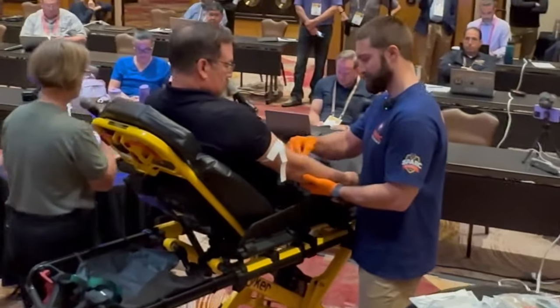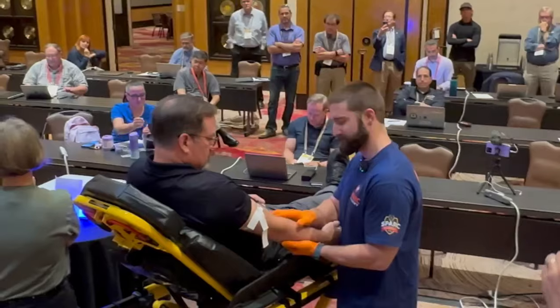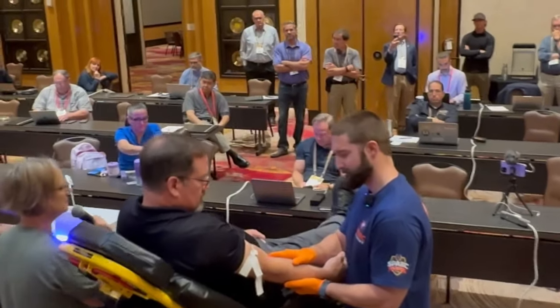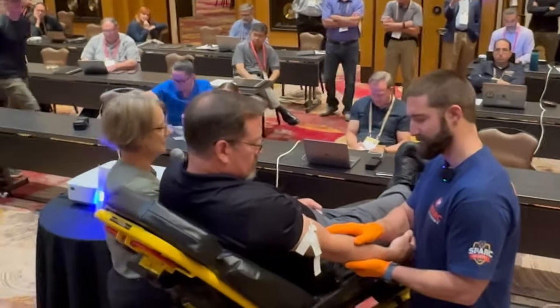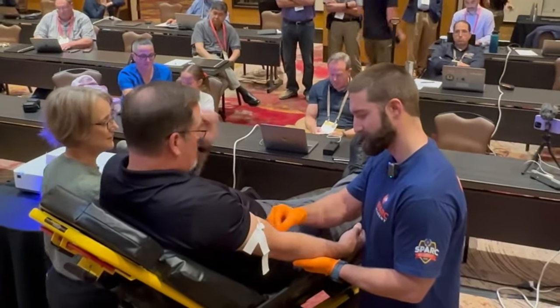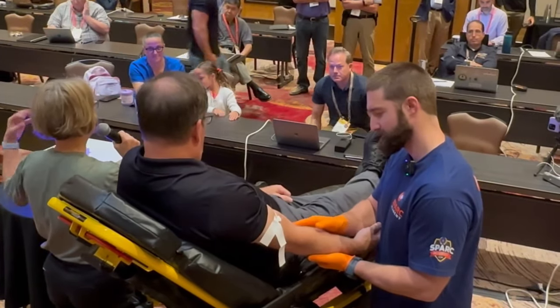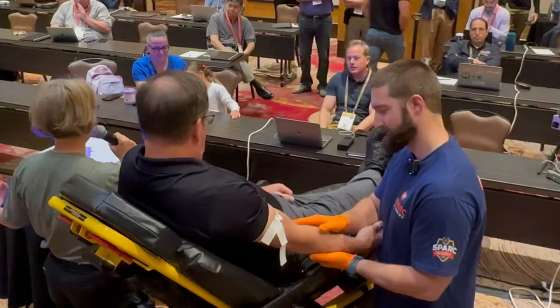Alex is doing typical site prep, cleaning it with an alcohol swab. The antecubital (AC) is the best place to get this — it's large bore and blood can flow out much quicker. He's palpating the site, cleaning it, and finding a good spot.